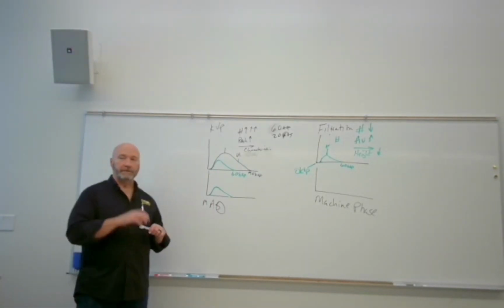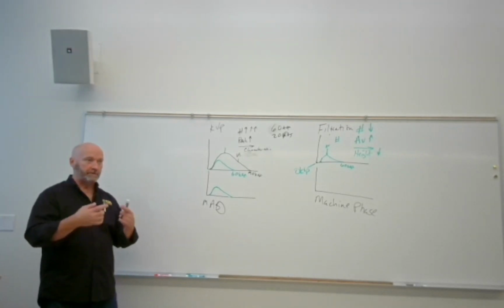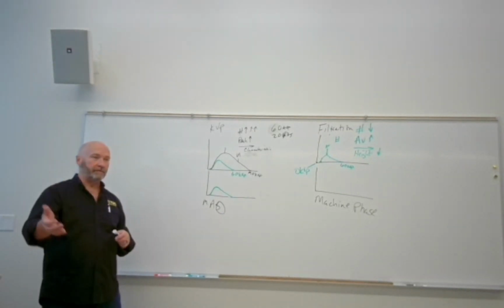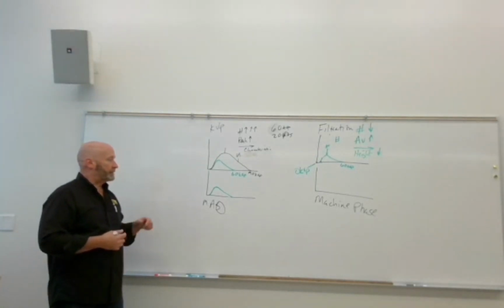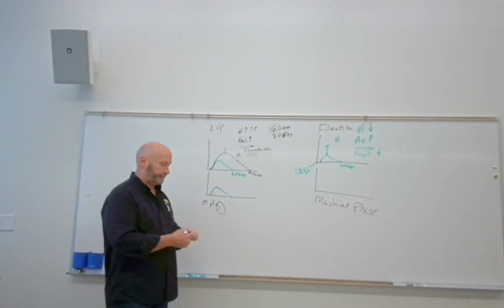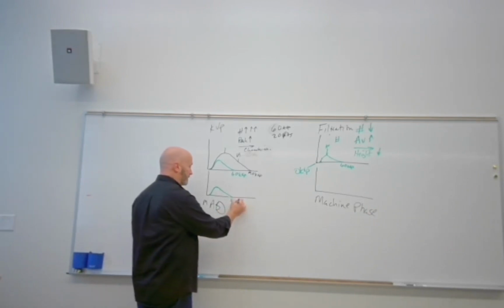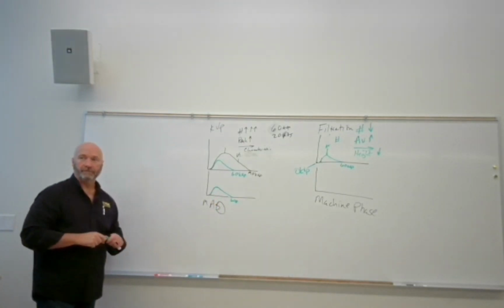What mA controls is the heating of the filament. So you heat the filament up, you get to the point of thermionic emission, right? You hit it with kVp and the electrons go across the X-ray tube. And it's just a count of electrons. So if it's just a count of electrons, how is that going to affect your peak energy? Trick question. It won't. So what's the only thing that affects your minimum energy? Filtration.